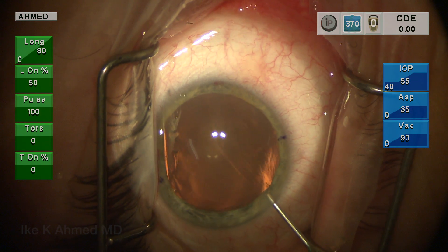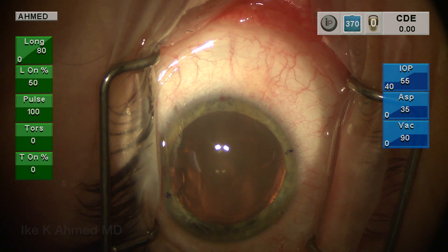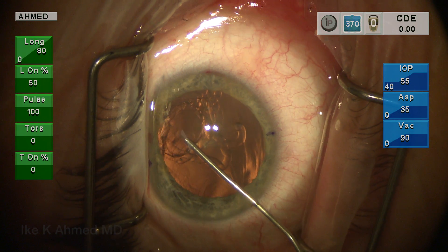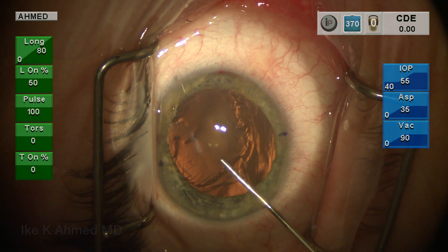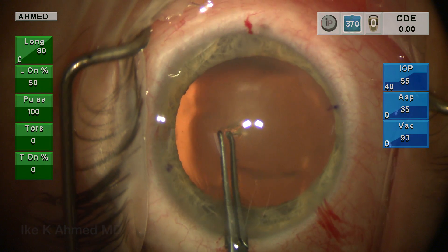This patient had a history of blunt trauma with resultant cataract and dilated atonic pupil that was measured to be between 6 to 7 millimeters preoperatively. She was also very motivated to try to be spectacle-free postoperatively and was keen on the multifocal lens, which we'll discuss shortly.